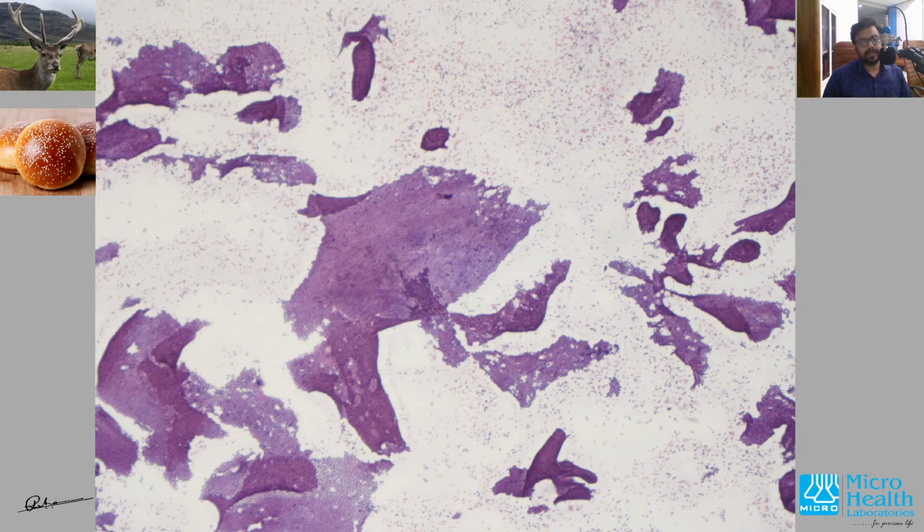So what we expect in a fibroadenoma is a cellular aspirate like we are seeing now. The smear will be very cellular, and what we see are the ductal epithelial cells. Fibroadenoma is a biphasic lesion or neoplasm in which there is a ductal as well as a stromal component. But in this case, mostly it is ductal that we are seeing. A stromal component was not seen in the slide. But we have to understand it is a biphasic neoplasm, in the sense that there will be a ductal component as well as a stromal component.